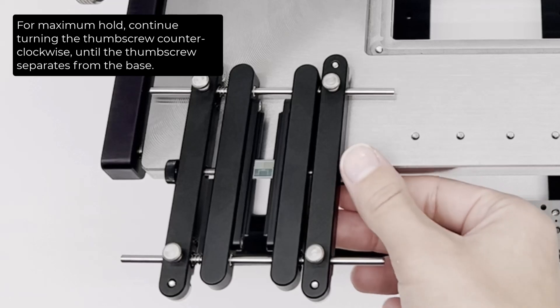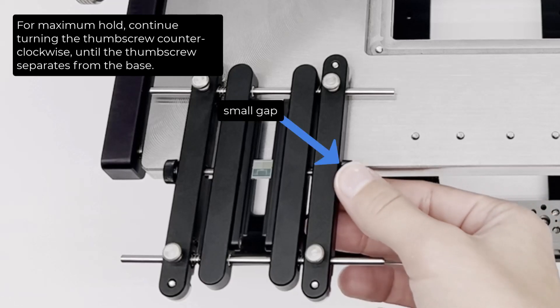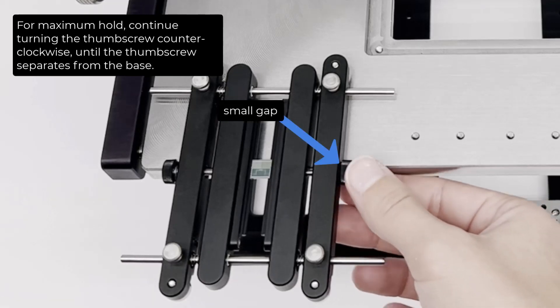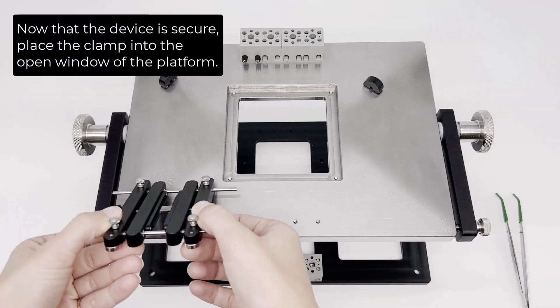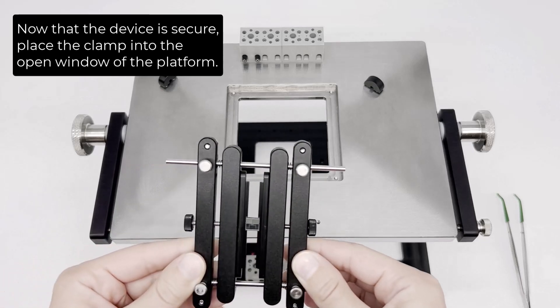For maximum hold, continue turning the thumb screw counterclockwise until the thumb screw separates from the base. Now that the device is secure, place the clamp into the open window of the platform.